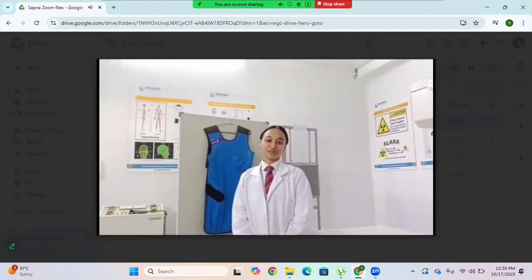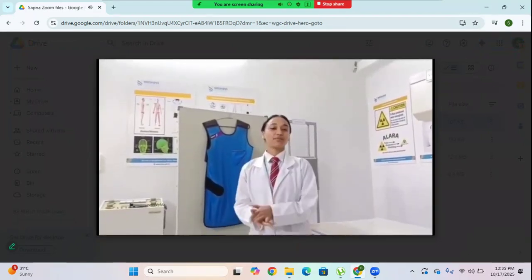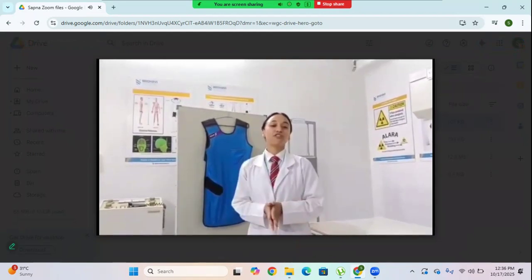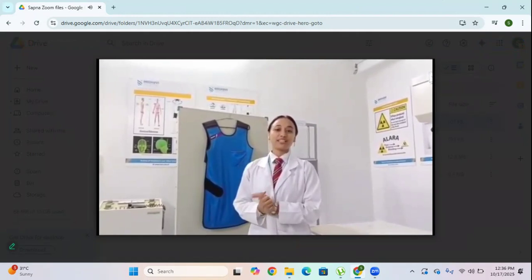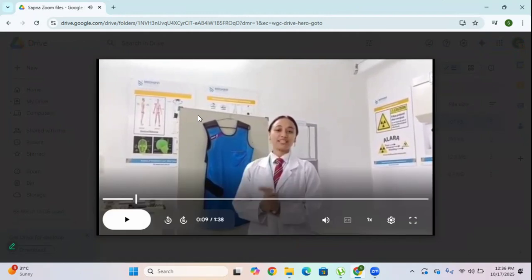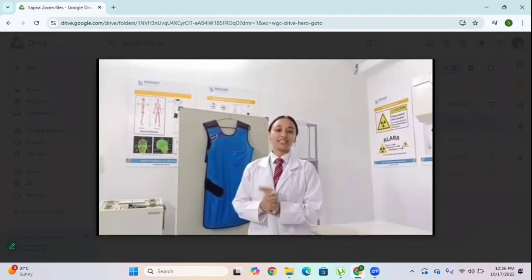So here before you all, I present my lab demonstration video. Welcome to the Radiology Department. Today I will be explaining the procedures and the positioning of the patient that we usually do in a tuberculosis patient. Before directly diving into the positioning and patient handling, first let's focus on the radiology lab.